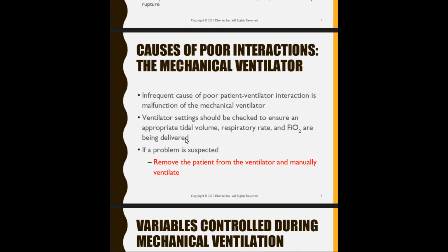And from that point on, you can either swap out the ventilator and tag and bag that for your biomed to fix, or it might just be a setting that's off. It could possibly be something wrong with the tubing, so it could be your circuit. It could be maybe your Ballard. Maybe someone suctioned and then pulled back too much, and now you have this really inflated bag around the catheter. I like to call it the balloon slug.